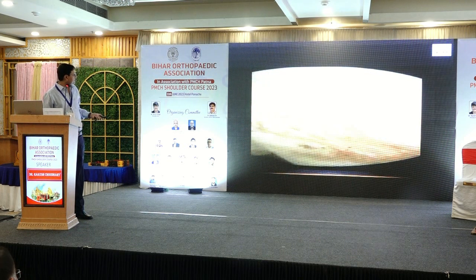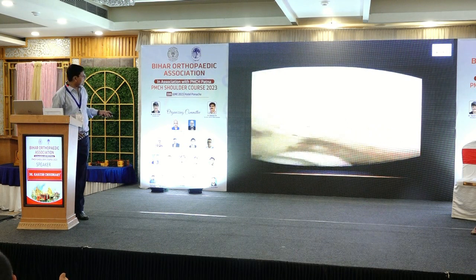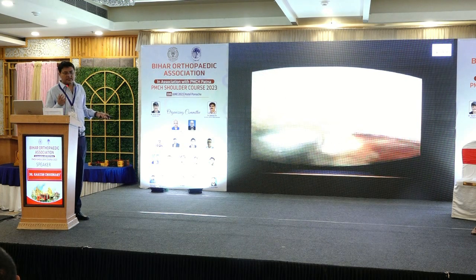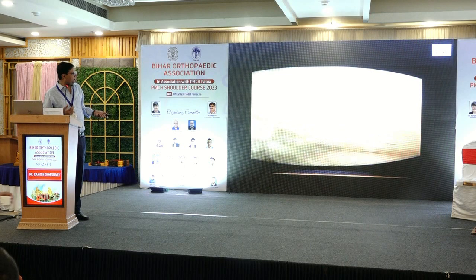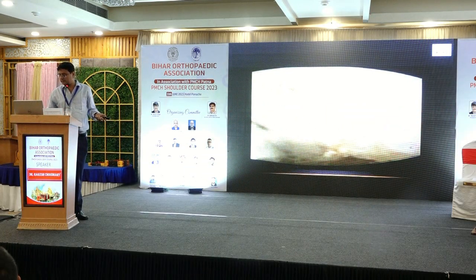You can see something glowing up here, and this is getting a brownish discoloration, and the tissue is removed millimeter by millimeter, even less, 0.1 millimeter at a time. You can coagulate very well, with no bleeding. All the bleeding can be stopped there.